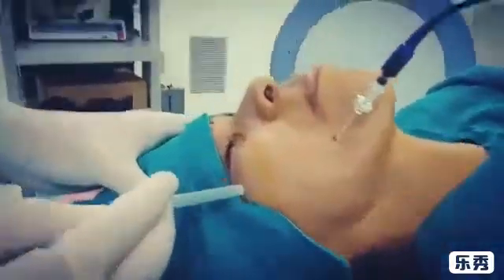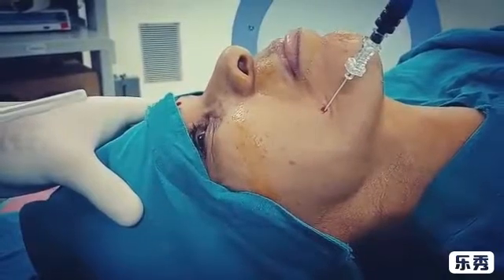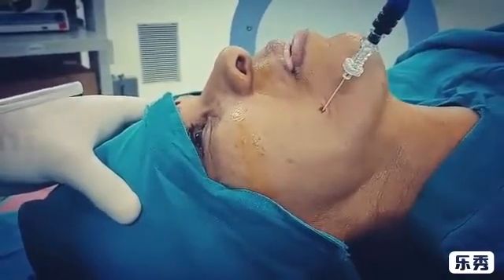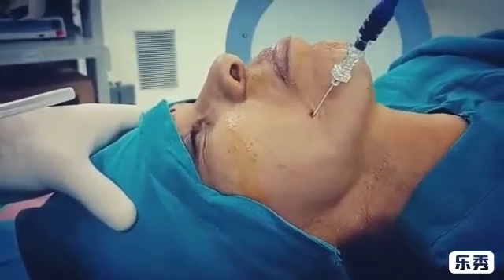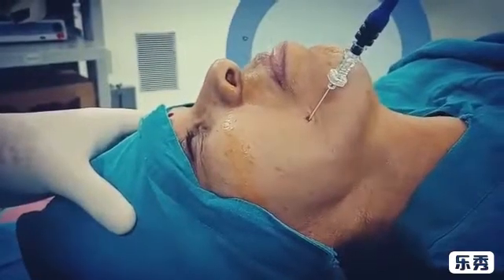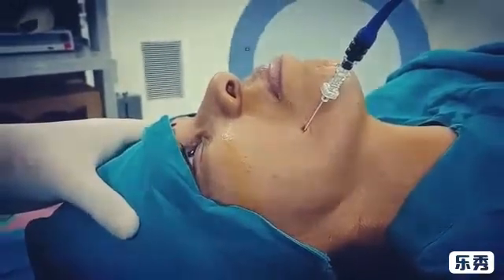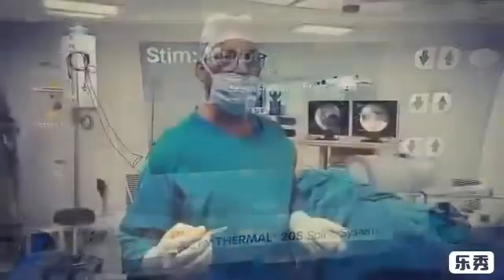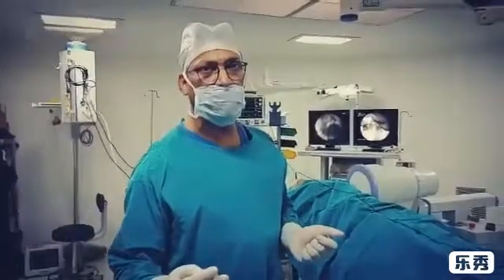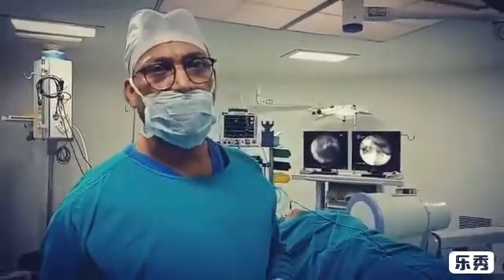At 0.3 mA we can get the sensory stimulation. We got sensory stimulation at 0.3 mA and motor stimulation at 0.4 mA. The nerve is very close to the mandibular nerve.